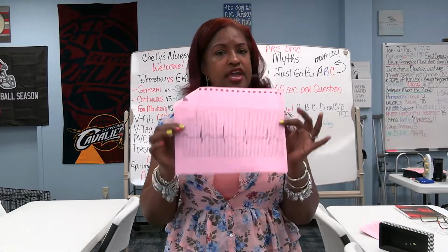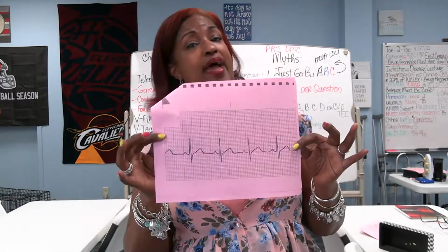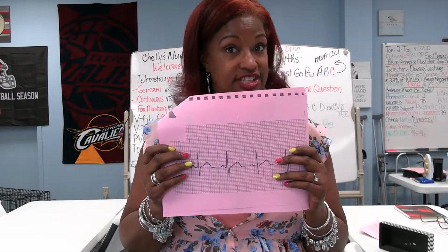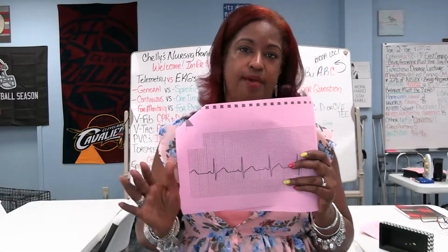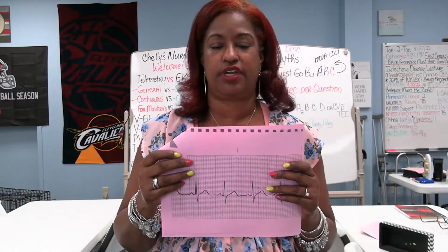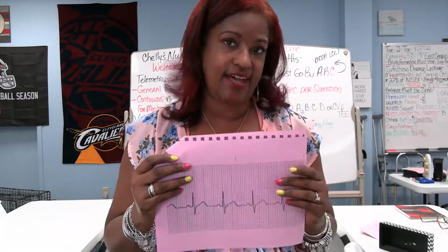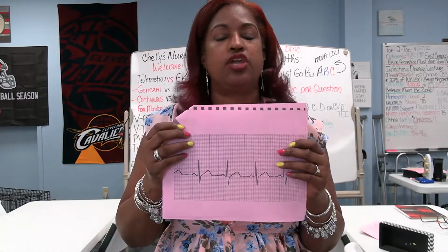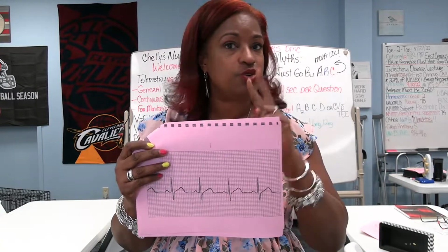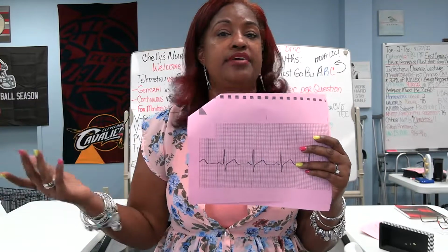So here's a handout that I use with many students, and it's exaggerated, totally magnified, super ridiculous, but that's okay because it's going to teach you. We know that the first step in the basics of EKG, or the basics of telemetry, is looking at the rate and the rhythm, right? Those two are just basics. And I find it's easier just to teach the student the rate real quick because they always get it.